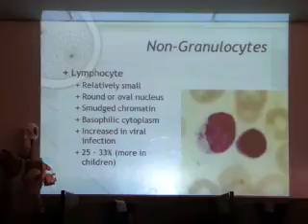Okay. Any questions so far on lymphocyte? Pretty simple, right? Okay. Now in your textbook, you might also see that you see more of these purplish inclusions in the lymphocytes with T cells, which is probably true. But morphologically, T cells and B cells, you can't really tell the difference. Okay, so don't rely on these inclusions to try to differentiate T cells and B cells. There are more immunologic ways you can use to differentiate the two, so don't rely on that.